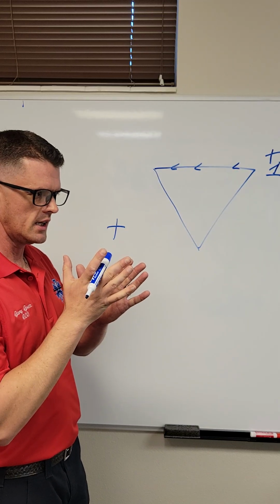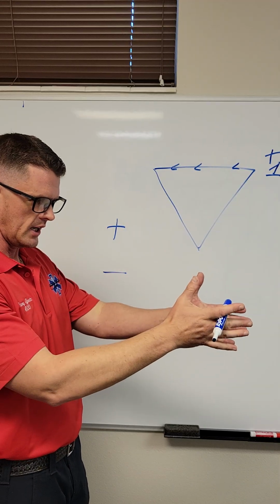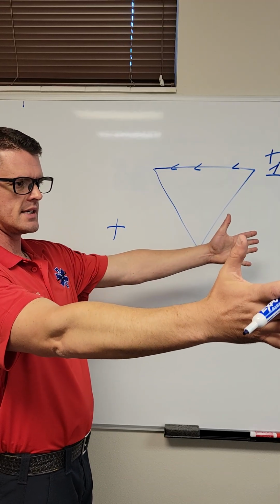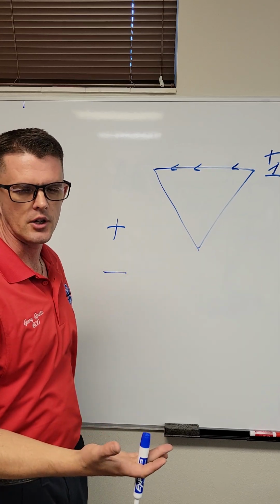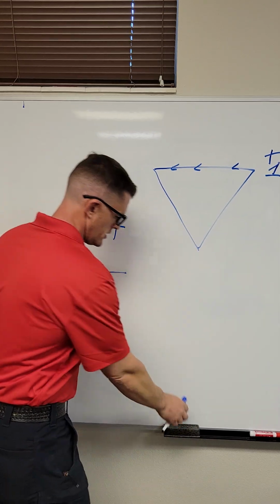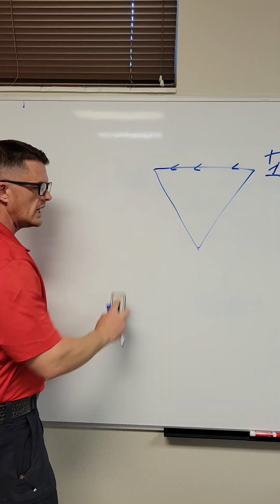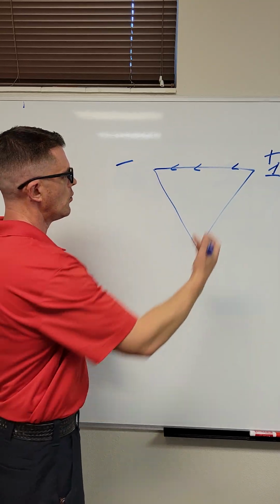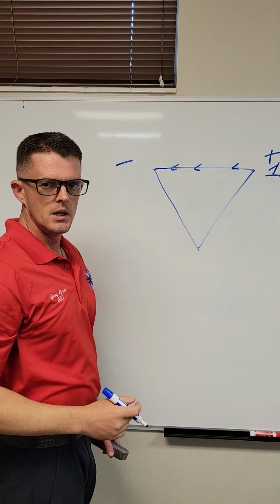Think about it almost like a beam of light. It's looking, but without something to focus on, it just widens out and it becomes very distorted, and you don't get a good picture. So if we're using lead 1, and I want to get a good picture, let me add a negative. Boom. So there. Now 1 has something to focus on. Okay?